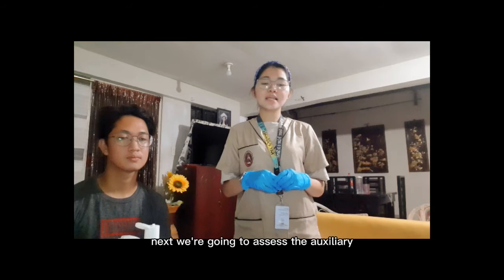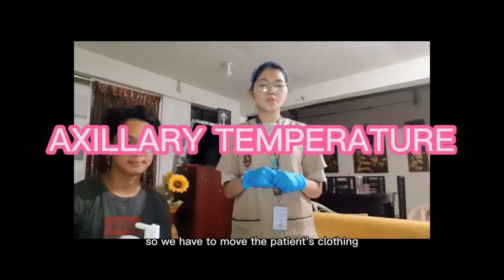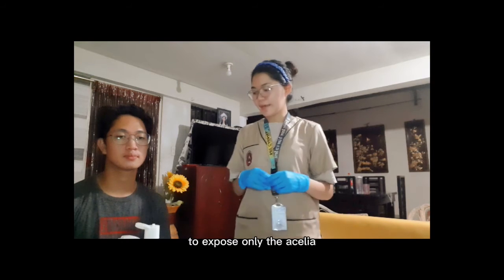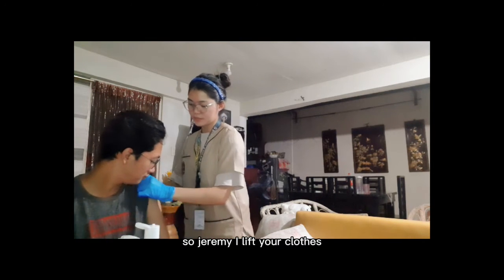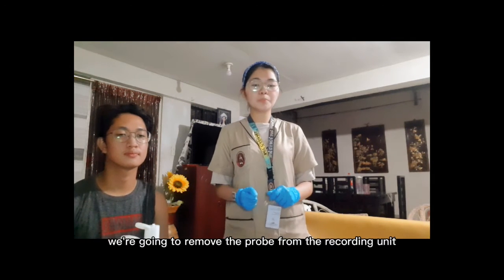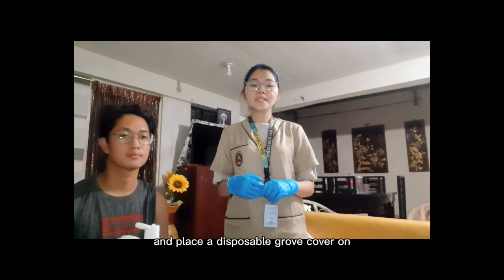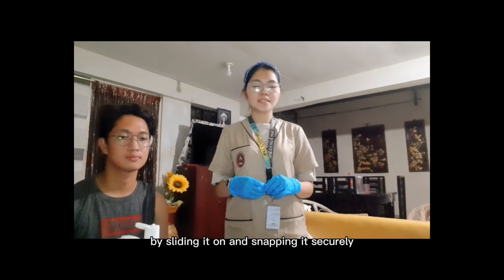Next, we're going to assess the axillary temperature of the patient. So, we have to move the patient's clothing to expose only the axilla. So, sir, may I lift your clothes? Alright. And after that, we're going to remove the probe from the recording unit of the electronic thermometer and place a disposable probe cover on by sliding it on and snapping it securely.